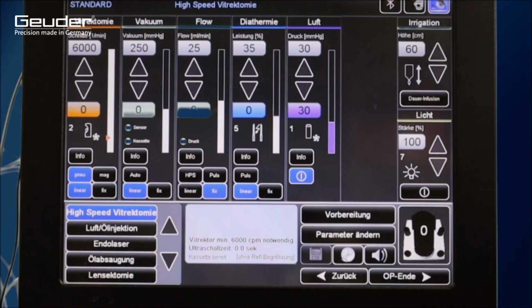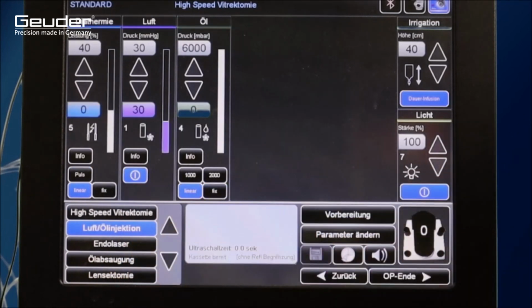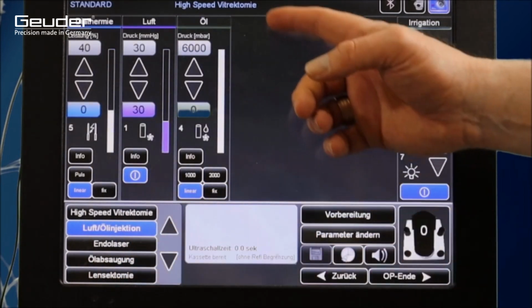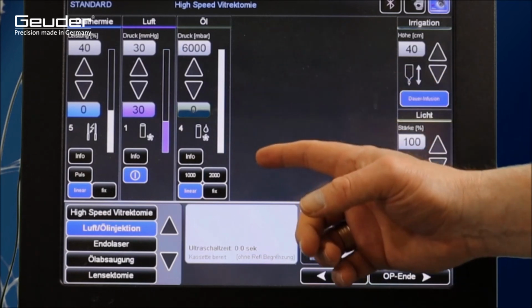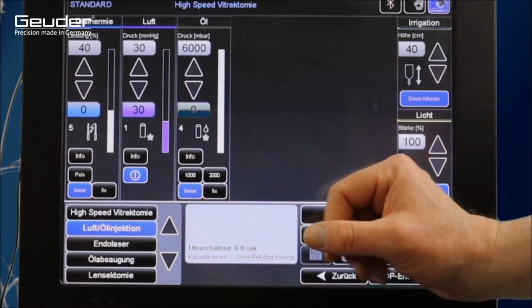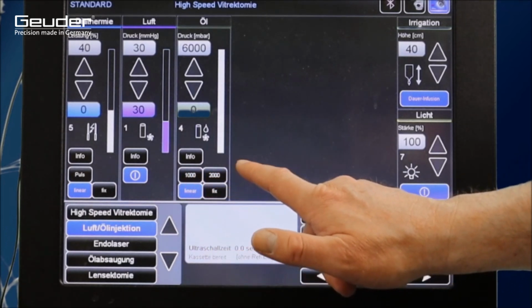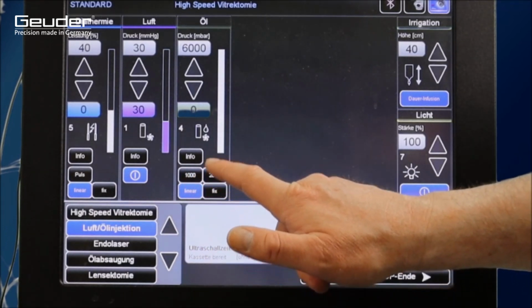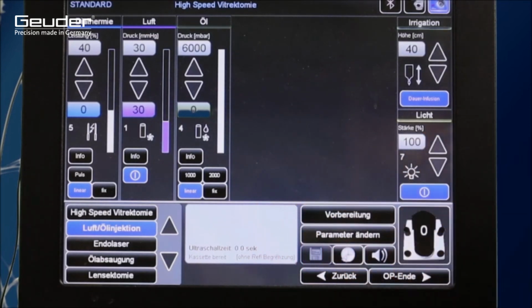The pressure with which the oil is injected into the eye can be set in the correspondingly programmed surgical step of the device's GUI. There are silicone oils of different viscosities, with a 2000 oil being less viscous than a 5000 oil. Furthermore, the Megatron S4HPS already offers presettings for pressure values for the use of 1000 and 2000 oils.